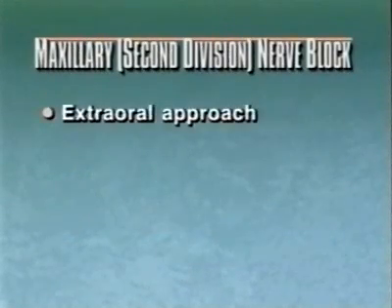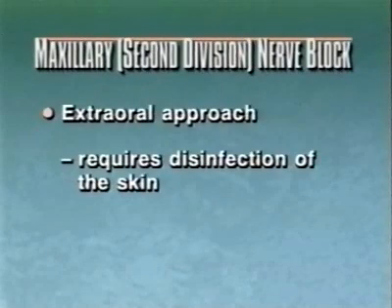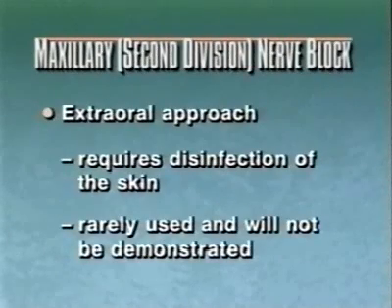The extraoral approach, in which the pterygopalatine fossa is accessed percutaneously, requires disinfection of the skin, is rarely used, and will not be demonstrated.